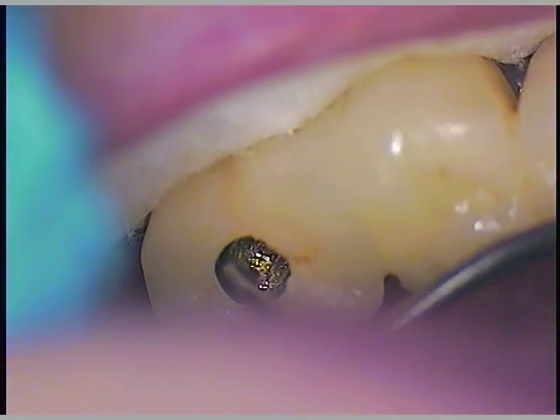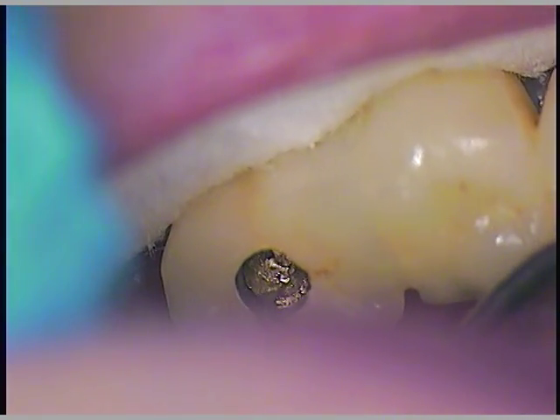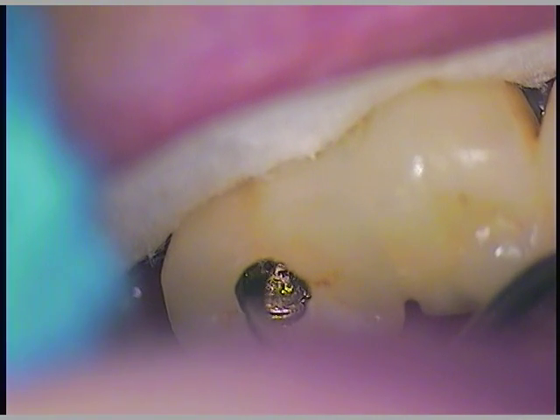We're going to go counterclockwise rotation — always counterclockwise. Stay in the middle. If we have a screw that's freed up, what a great thing. Then we can take the bonding off.